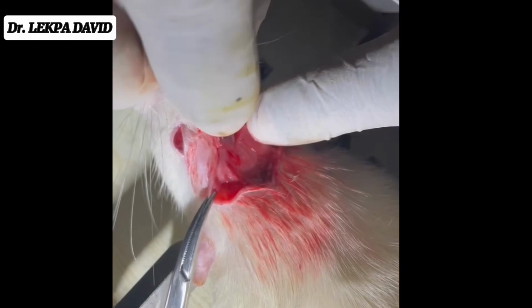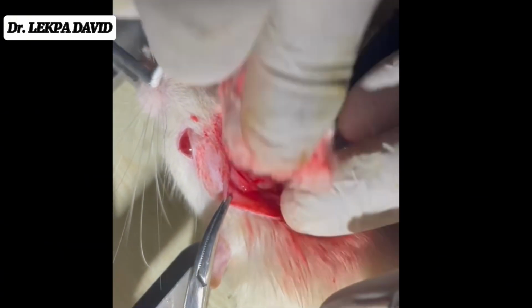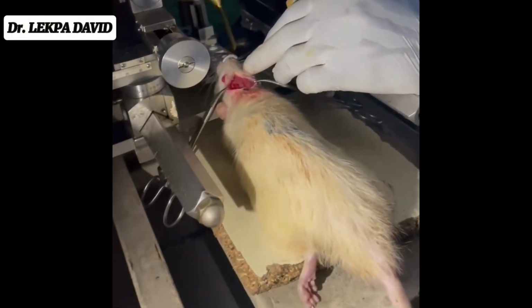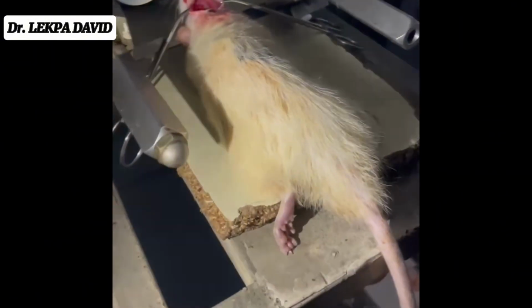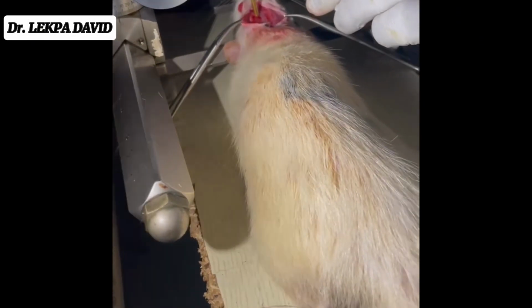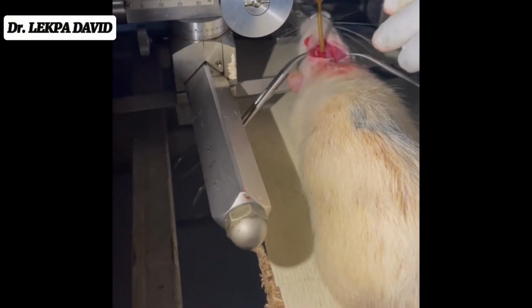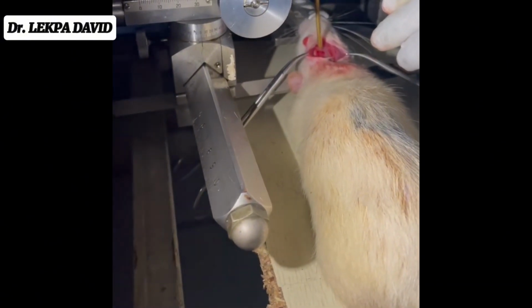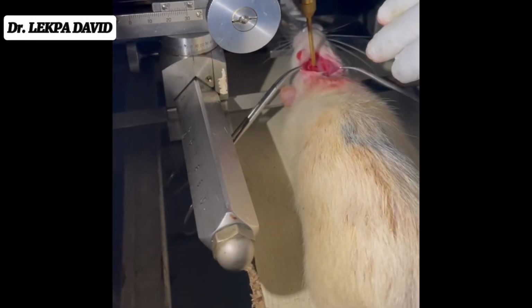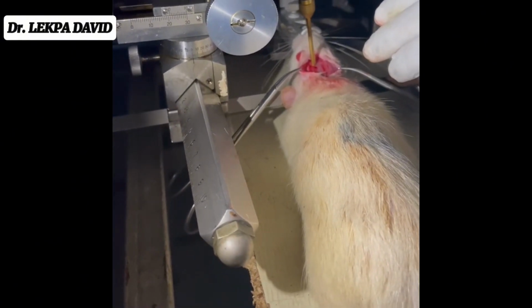During this procedure as well, we applied eye drops to the eye, so the eye remains moist and it doesn't go blind. Now you can see me here actually using the drill. Now this drill is not the designed drill for such a procedure, but it was the only one we were able to find. The drill that was designed for this procedure was quite expensive for me to afford, so we stuck to this one.